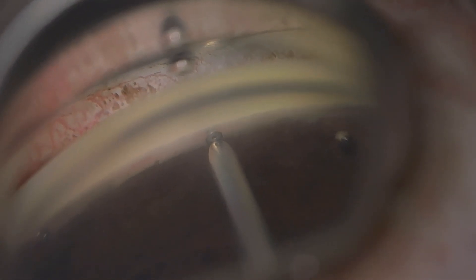And so we go back in and plant the stent well here with good visualization. And you can see I'm just tapping on the stent to see that the body of the stent is in Schlemm's canal.